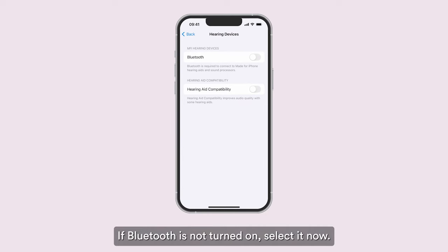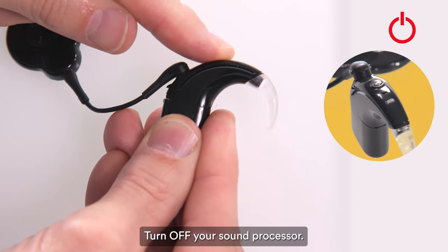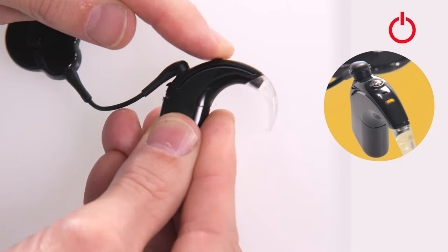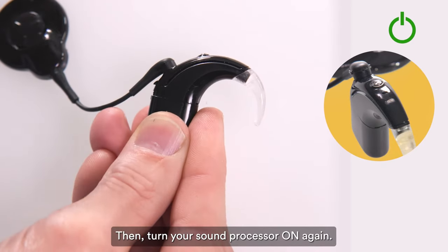If Bluetooth is not turned on, select it now. Turn off your sound processor.